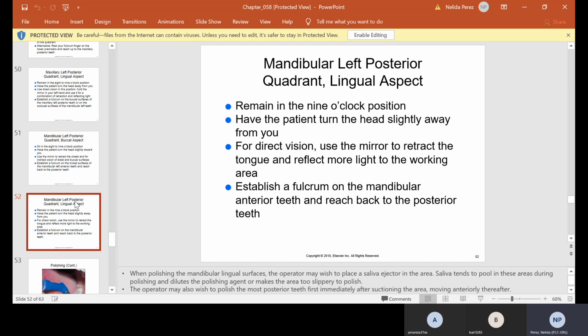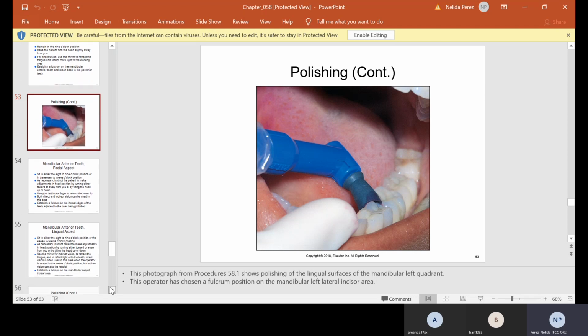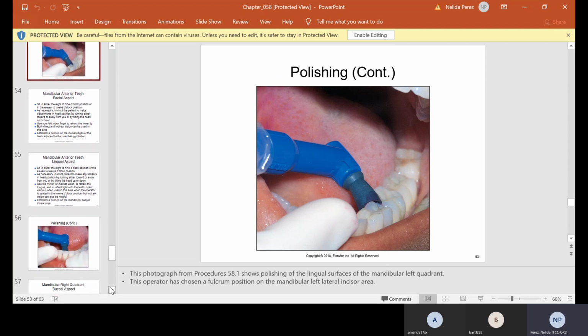And on your mandibular left posterior quadrant, you want to remain in the 9 o'clock position. Have the patient turn the head slightly away from you. For direct vision, use the mirror to retract the tongue and reflect more light to the working area. Establish a fulcrum on the mandibular anterior teeth and reach back to the posterior teeth. So here is a picture on the lingual side. I will do a video or find a video so you guys can watch it of a polishing.